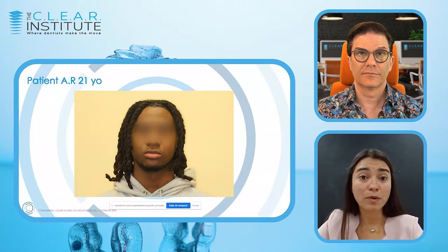And then when we take these images and we do a more in-depth evaluation, the first thing that we look at is the harmony and the symmetry of the patient's face. Let's take a look at Andrew as an example. We're going to analyze him today very deeply, and we can see that his facial thirds are very equilibrated, right?